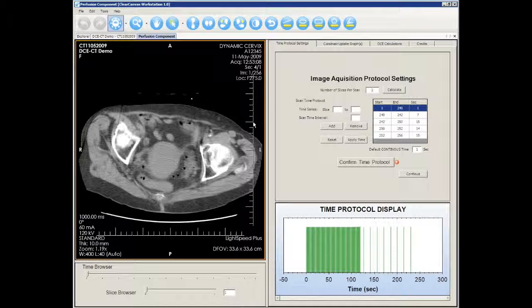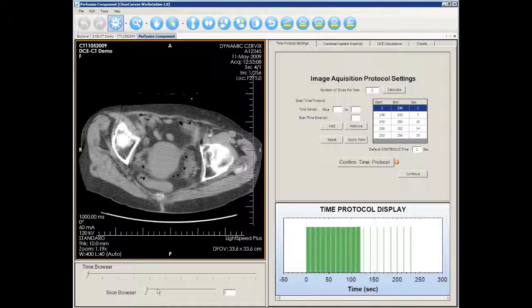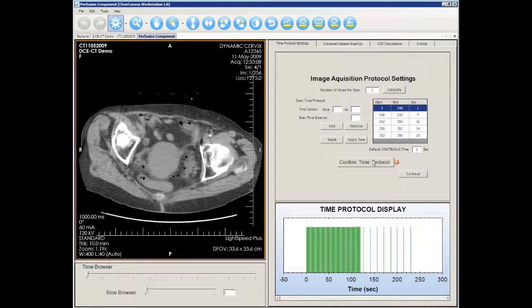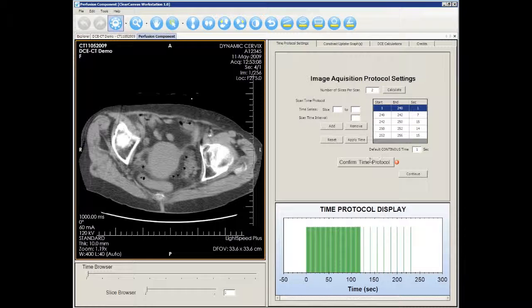Once the DCE Tool is launched, the screen is divided into three sections. The left side contains your image dataset and a time browser to help you browse through the images. The right side is the image acquisition protocol settings.